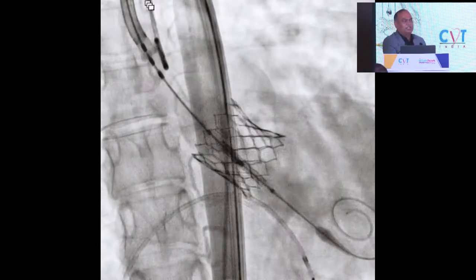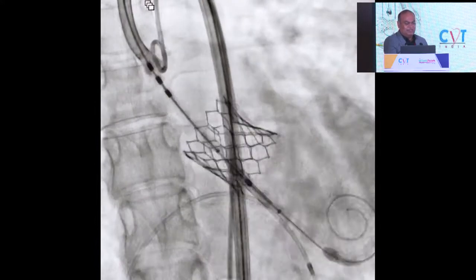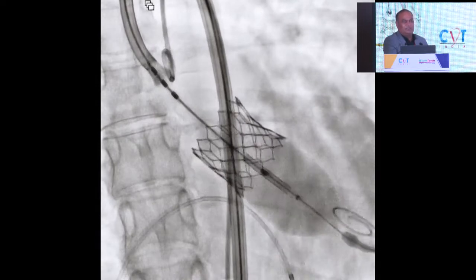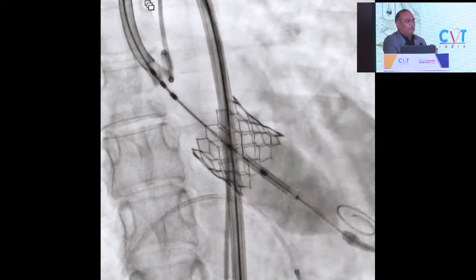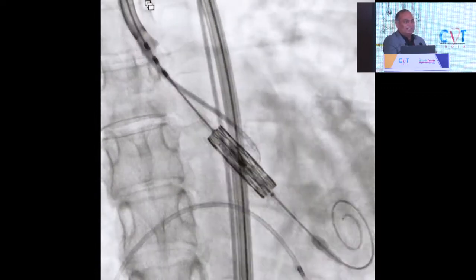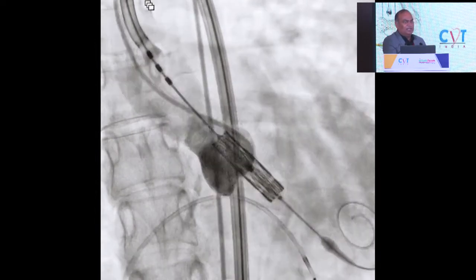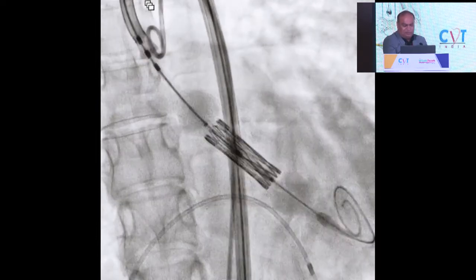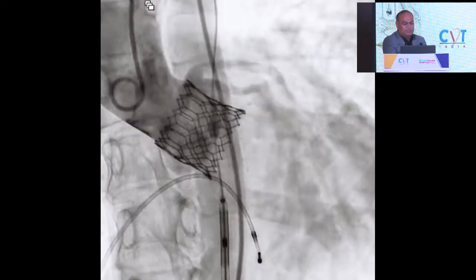Just do a partial deployment, deflate. This will anchor the stent frame. Deflate, advance the balloon forward, and just do the ventricular dilation. This way, you've avoided STJ injury from the balloon. If the STJs are calcified, they will watermelon seed it down in the ventricle. If they're not calcified, you'll cause an injury. So, two-stage deployment in case of very narrow STJ. This is the final result.